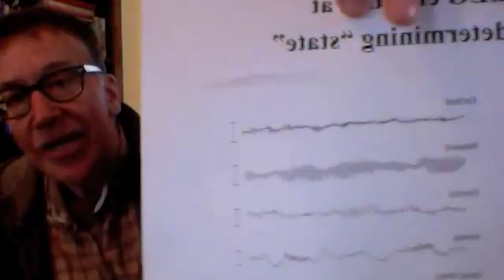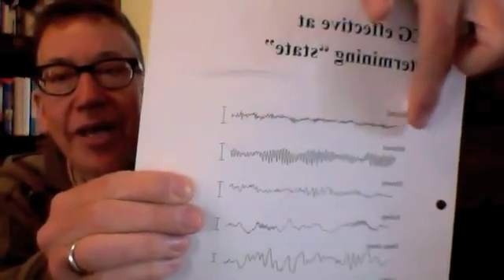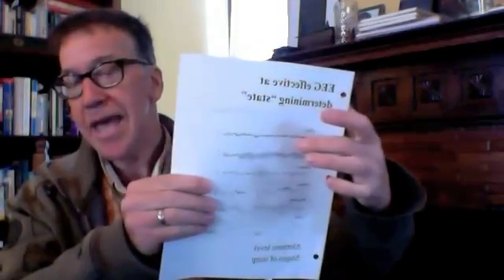So this is an EEG recording from somebody, it says here, excited, somebody who, let's say, has their eyes open and is processing information. Let's say we're recording from an electrode located at the caudal portion of the scalp, so we're recording some kind of visual processing, back here around the occipital lobe. If you're actually looking around your world and processing all this visual information, you're going to see waveforms that are very low amplitude and very high frequency, very fast.